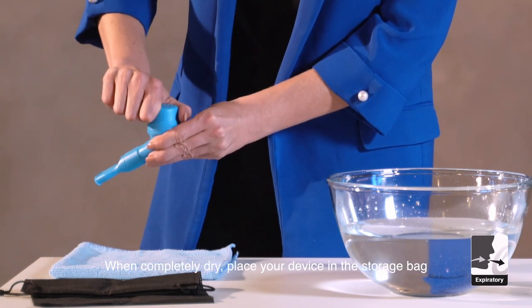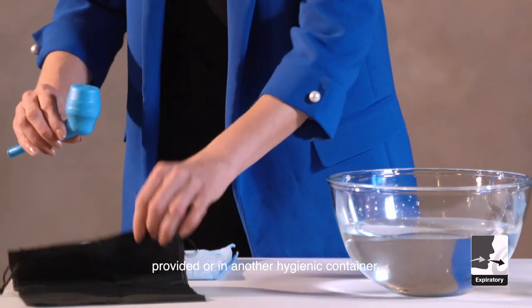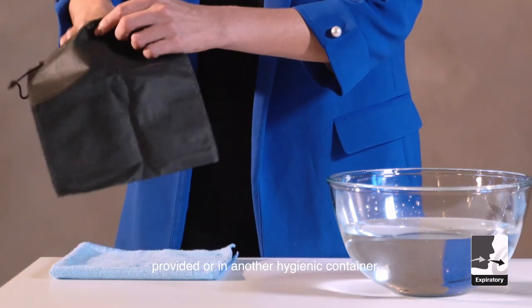When completely dry, place your device in the storage bag provided or in another hygienic container.